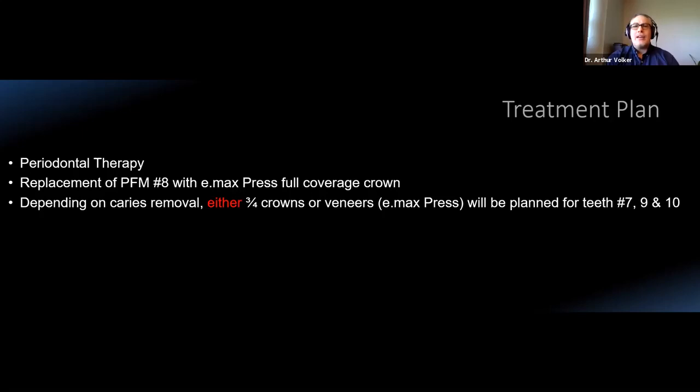I don't know. It doesn't matter. See, with a crown, we are relying on retention and resistance form. I mean, technically we can bond it, true, but there is, let's say it this way, a retention and resistance form inherent in our prep design. And that's what is done from using conventional luting.